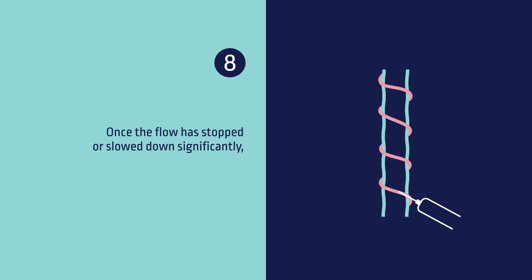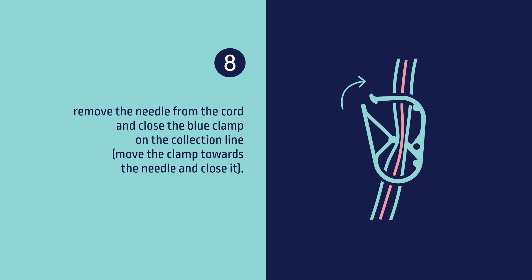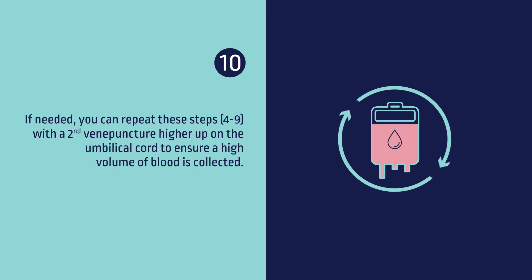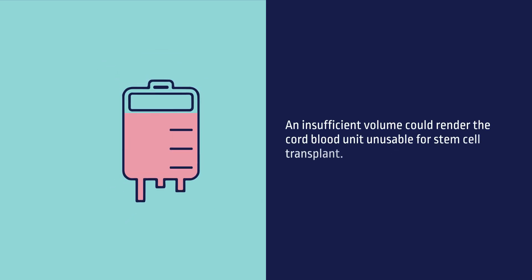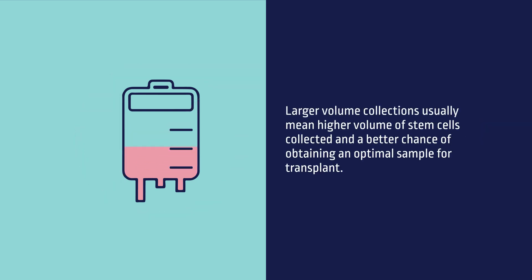Step 8: Once the flow has stopped or slowed down significantly, remove the needle from the cord and close the blue clamp on the collection line. Step 9: Secure the needle by sliding the red needle guard over it until it clicks into place. Step 10: If needed, you can repeat these steps with a second venipuncture high up on the umbilical cord to ensure a high volume of blood is collected. 100 to 150 ml of blood is required for a successful collection. Please note the calibrations on the collection bag. An insufficient amount could render the cord blood unit unusable for stem cell transplant. Larger collection volumes usually mean a higher volume of stem cells collected and a better chance of obtaining an optimal sample for transplants.